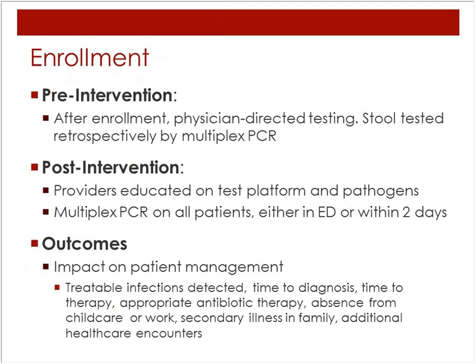For the pre-intervention phase, the patients were enrolled and observed, meaning that standard of care testing for GI pathogens was performed at the discretion of the provider. Stool samples were requested from the patients, but only for retrospective testing on the FilmArray panel. So these results were not reported to the provider or in the medical charts.